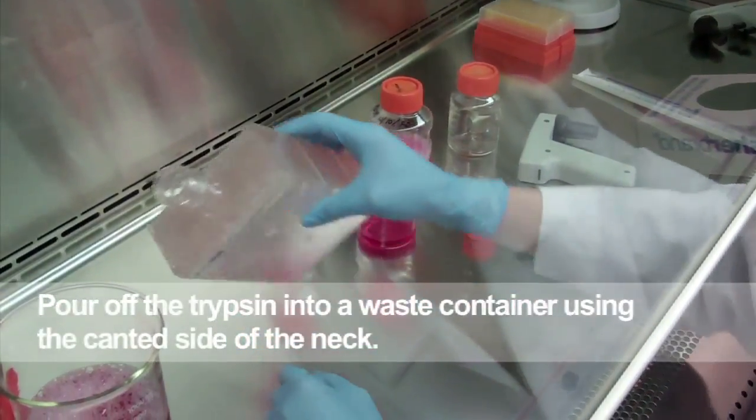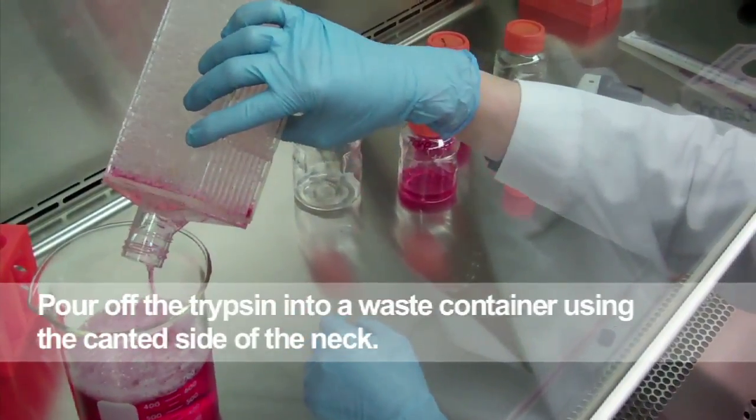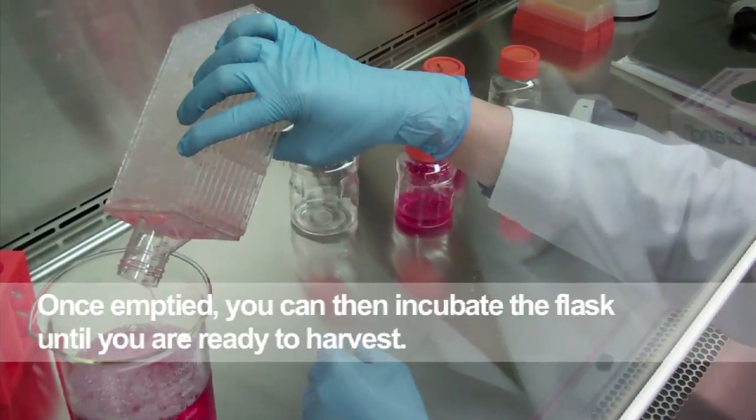Again, pour off the trypsin into a waste container using the canted side of the neck. Once emptied, you can then incubate the flask until you are ready to harvest.